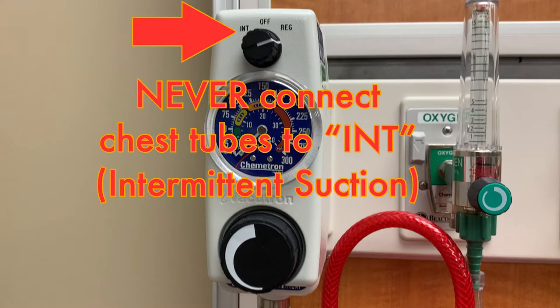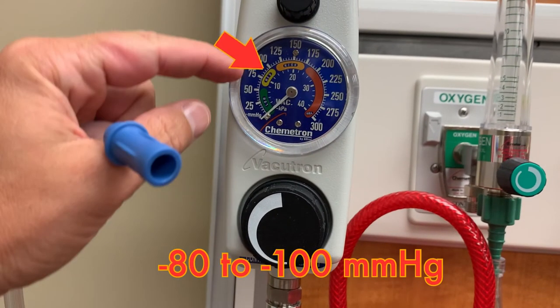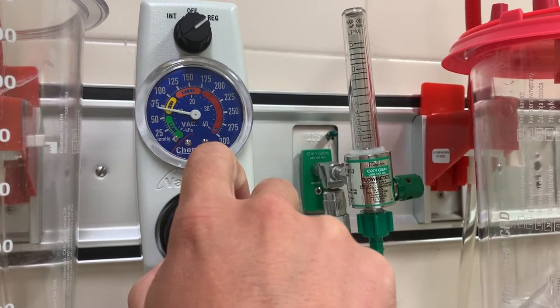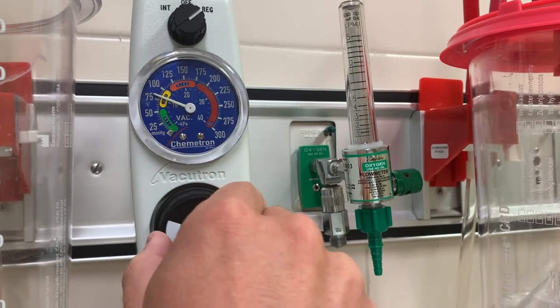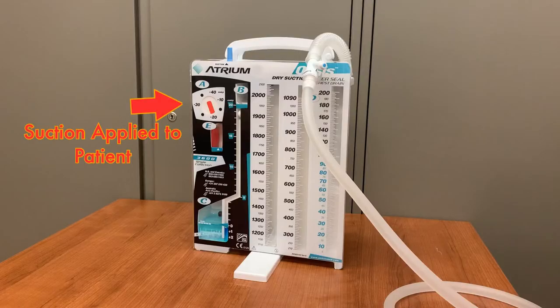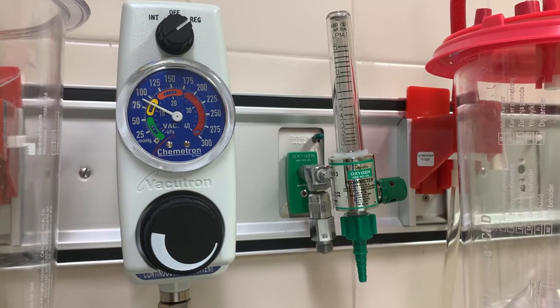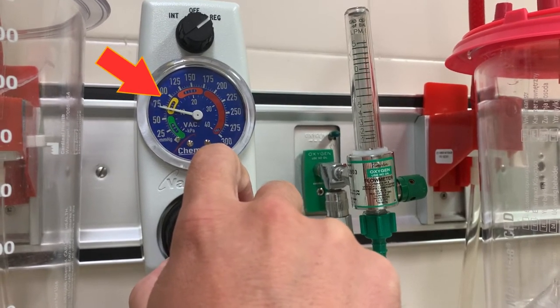Do not connect chest tubes to intermittent suction. The suction control unit should be set between negative 80 and negative 100 millimeters of mercury. Obtain this setting by turning the large knob on the bottom of the unit until the needle rests within this range. The wall unit must be set between negative 80 and negative 100, but the Oasis itself will regulate the suction applied to the patient. However, in order to function properly, the Oasis must receive between negative 80 and negative 100 from the wall suction. If the orange bellows aren't expanded properly, always check the wall unit first to ensure the proper amount of suction is being delivered.